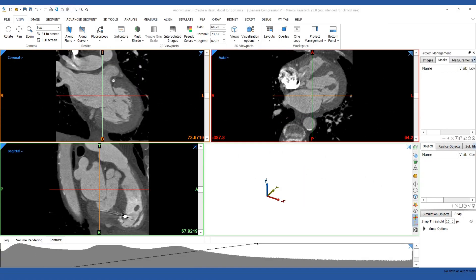Hello, my name is Simon and I'm an application engineer at Materialize. In this video I'm going to show you how to create a hard model for 3D printing in the Mimics Innovation Suite. We're going to cover the entire workflow for using the Mimics Innovation Suite to create a hard model for 3D printing.